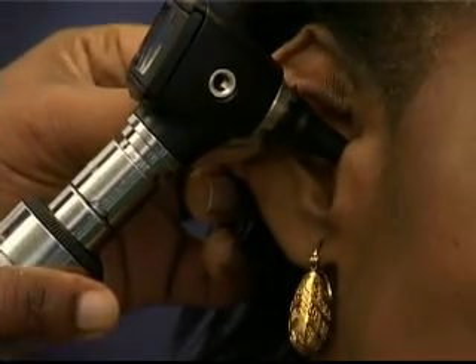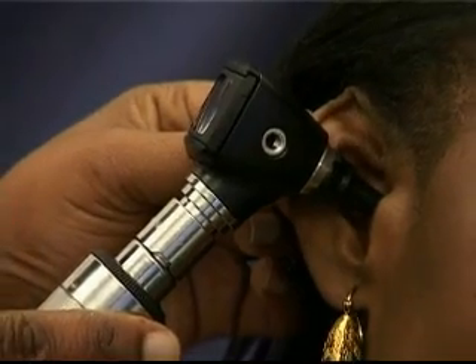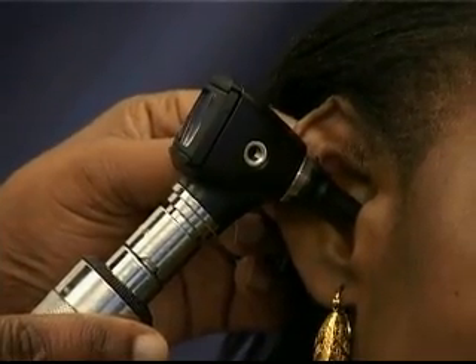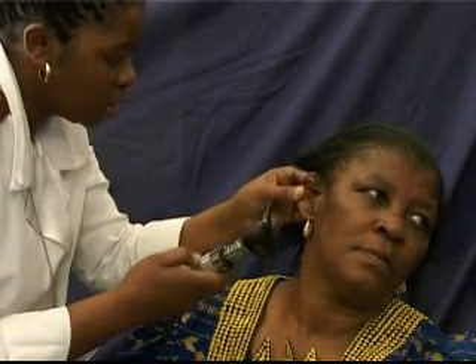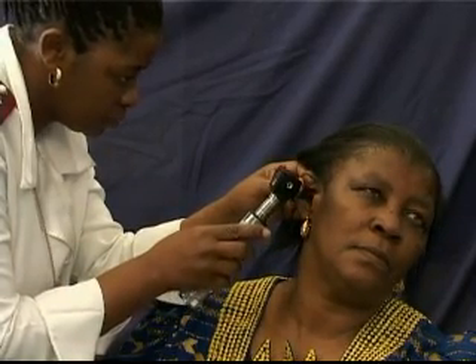When inserting the speculum, the ear canal should be as straight as possible to ensure a clear view of the tympanic membrane and ear canal. This is done by holding the outer cartilage part of the ear, the pinna, firmly but gently and pulling back for children and up and back for adults. Insert the speculum gently into the ear canal and look through the glass window of the otoscope, which is a magnifying lens.